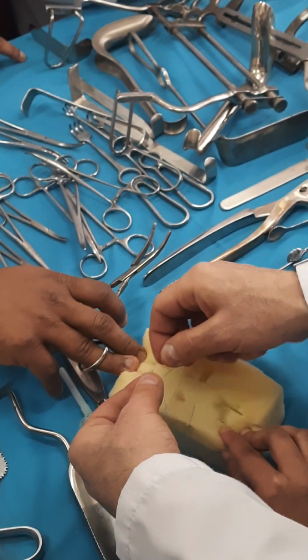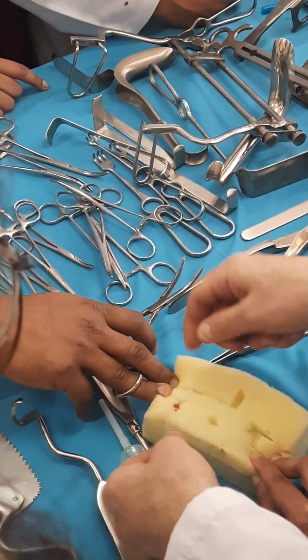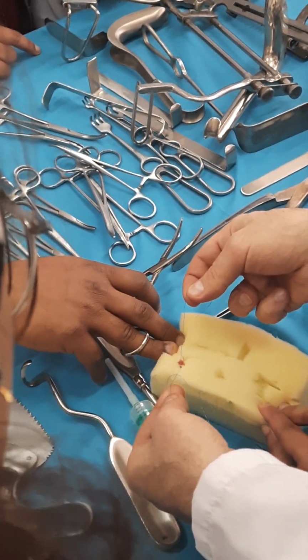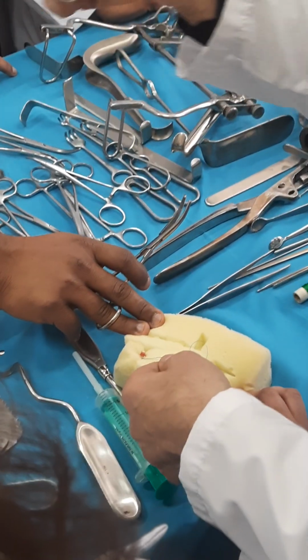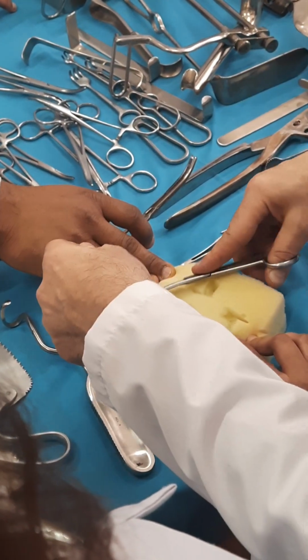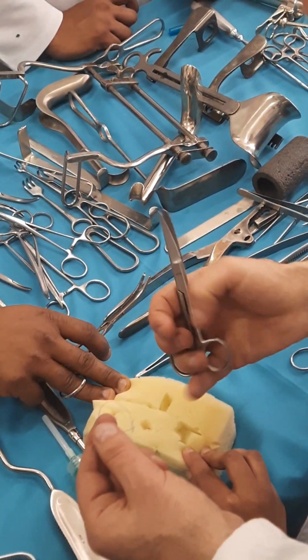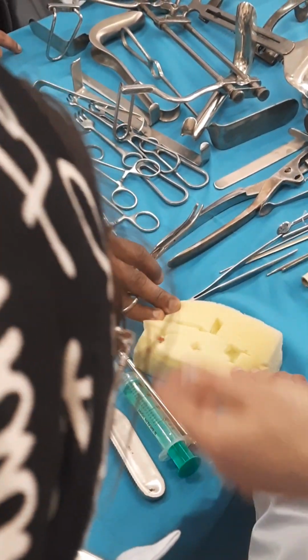I continue my manipulation. I make the second knot. Usually for such kind of thread, I will make minimally 4-5. Why? Because it is monofilament, one fiber. If I apply less than 4-5 knots, it can spontaneously open. What after? I apply the scissors, I turn the side, I measure the size of the cutting portion, and I cut. This method now, how will you call this method?